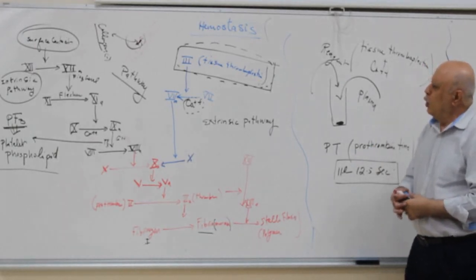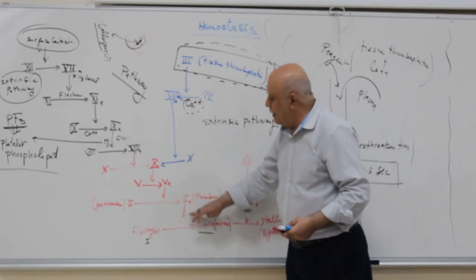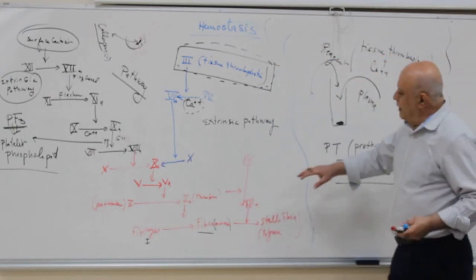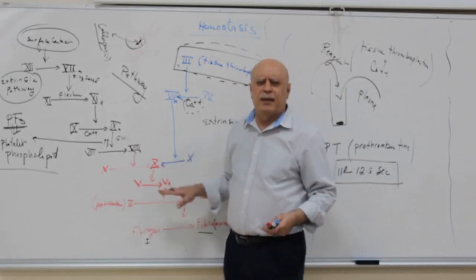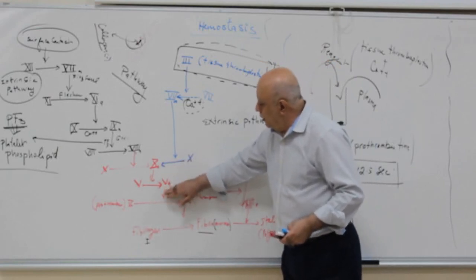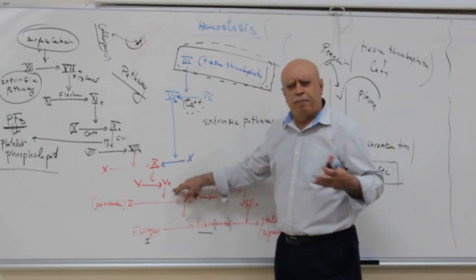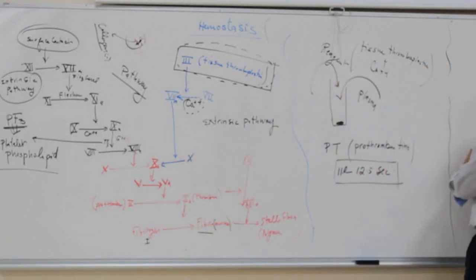In other words, these clotting factors are normal, not decreased. Otherwise, if one of these clotting factors is decreased for some reason, or is not there, or is in short supply, it will take longer to clot.